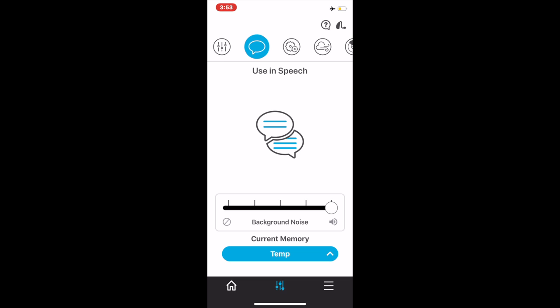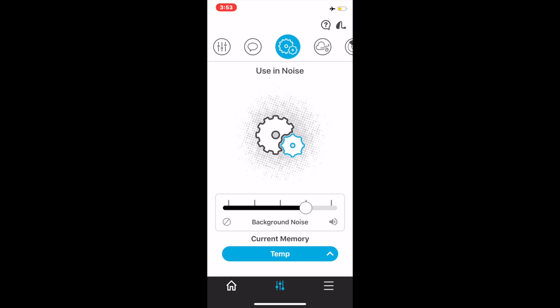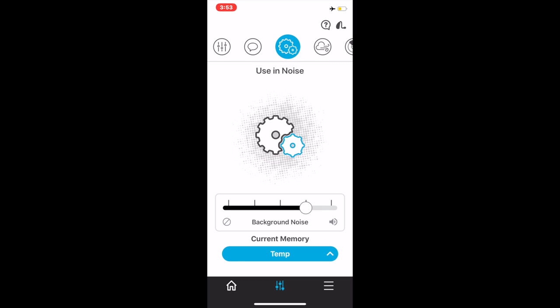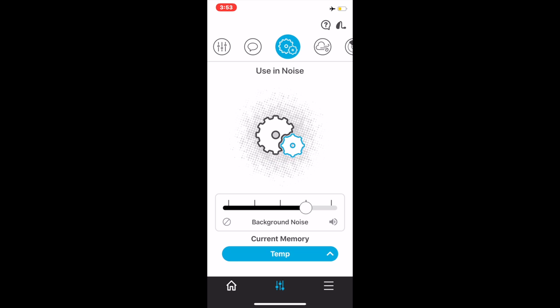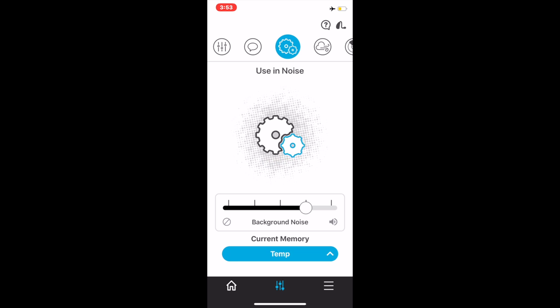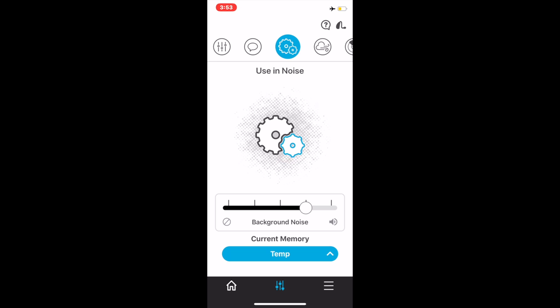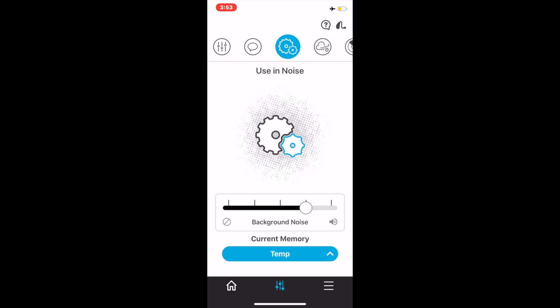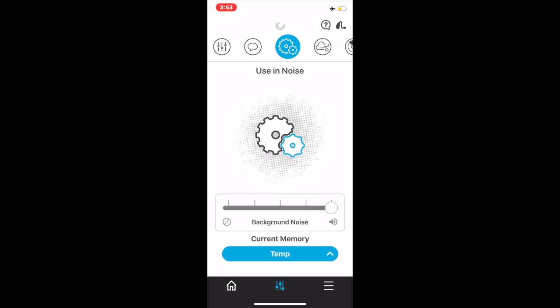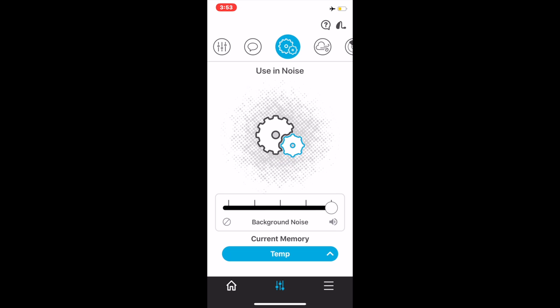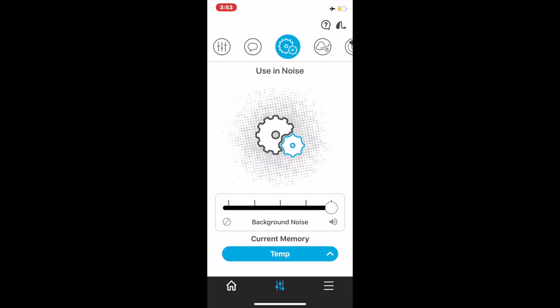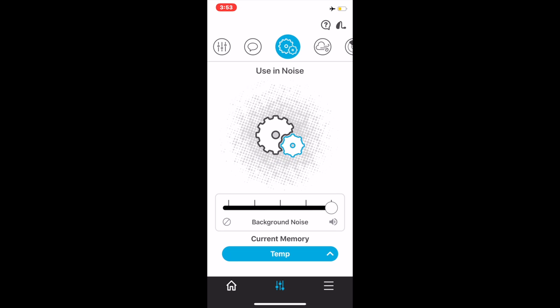At the top, the gear icon is looking at machine noise. The machine noise reduces sound produced by machinery, again, to increase your comfort in loud environments. By setting it further to the right, it will provide more comfort in a noisy environment.